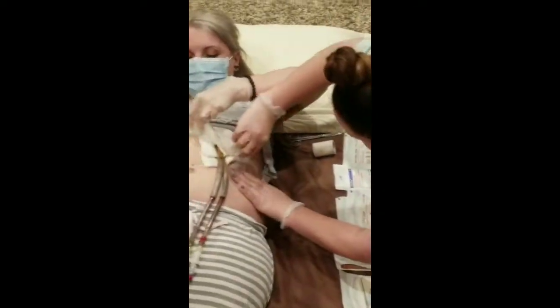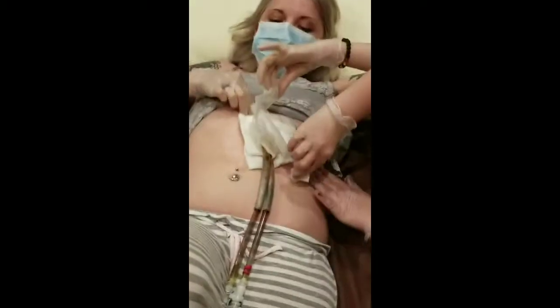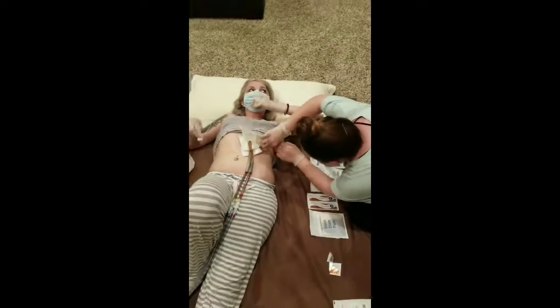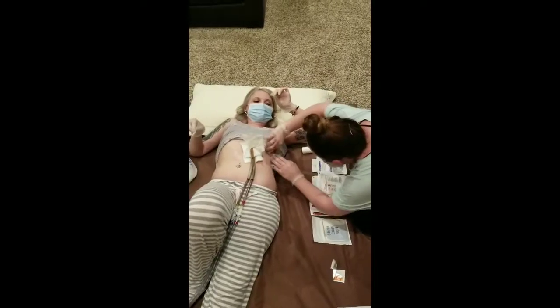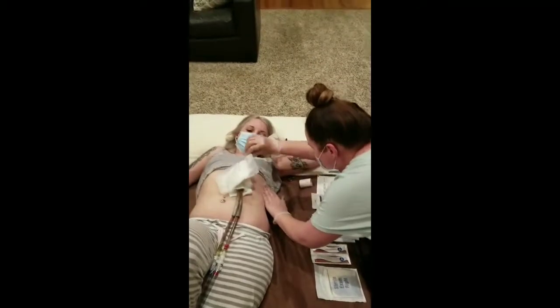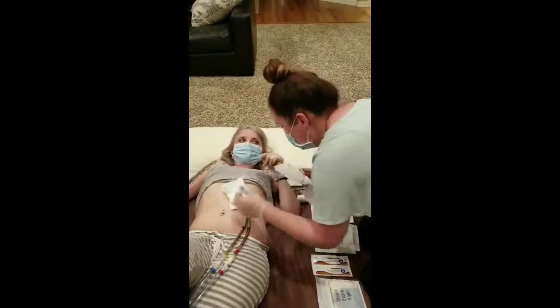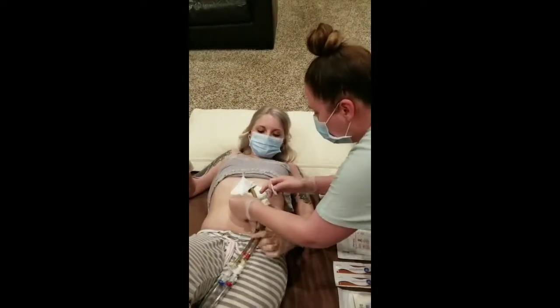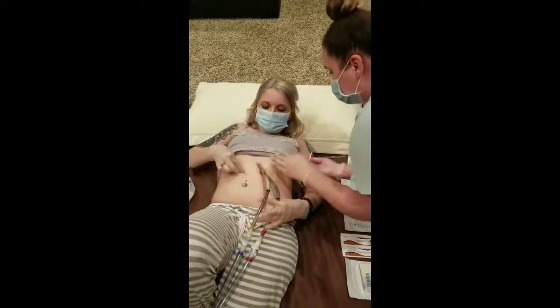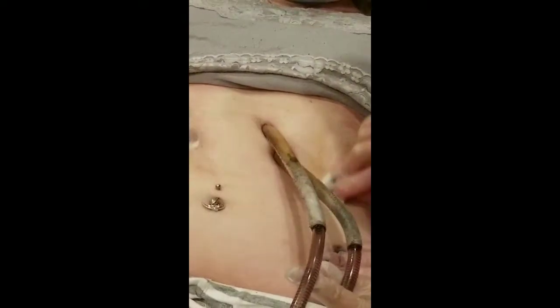The reason we use these alcohol pads is because it helps loosen up the tape. We don't want to pull too hard because it will irritate her skin. We're wearing the mask because we don't want to contaminate anything, and later we will be switching to a sterile glove. So we're removing the dressing and also using the alcohol pad to remove a little bit of adhesive.